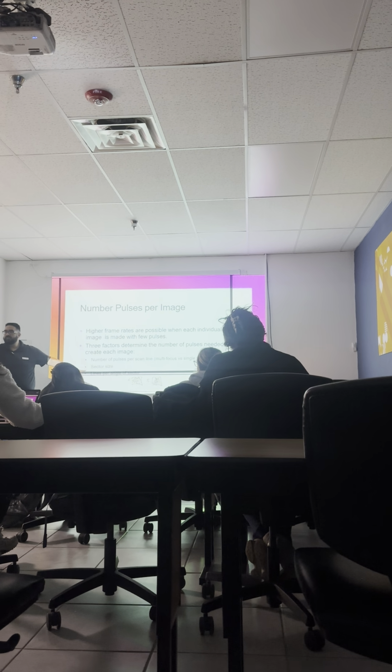Now if we have the scan lines to cover the whole liver, then we get the whole picture of the liver accurately. Remember, we're trying to improve resolutions. We're trying to make it look more accurate. So we do get a better image here, but our temporal resolution goes down. But at this point, we don't care about that because our liver doesn't move, right?